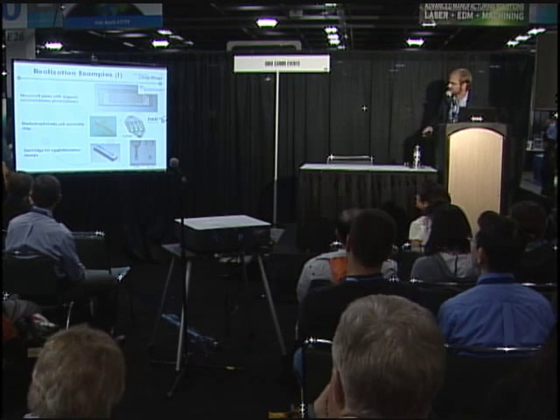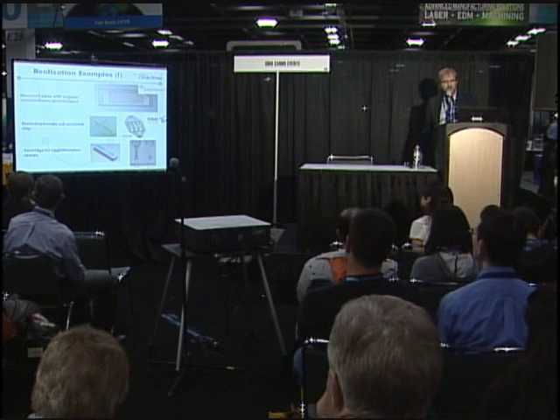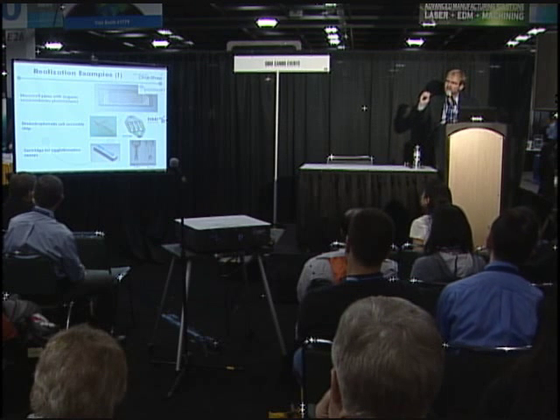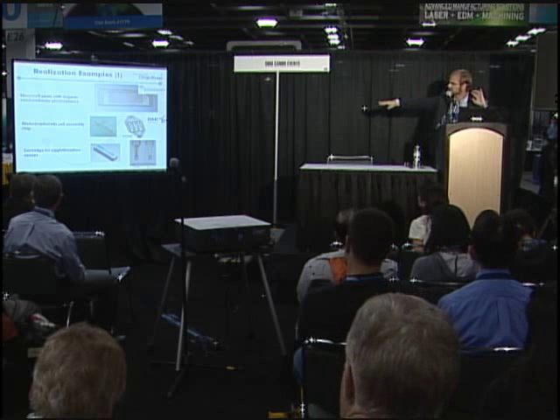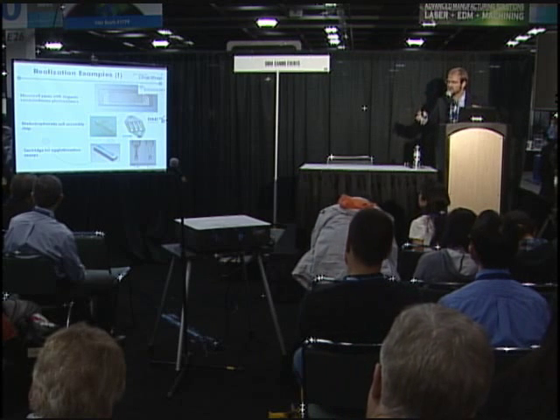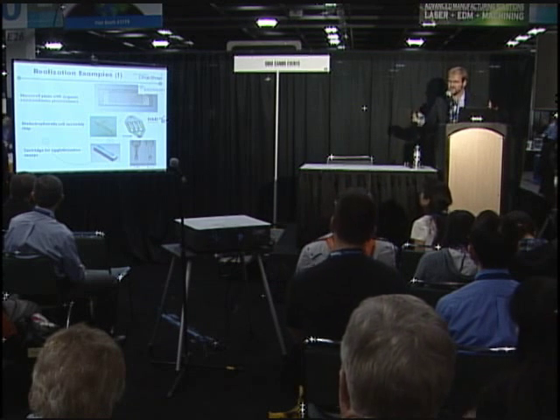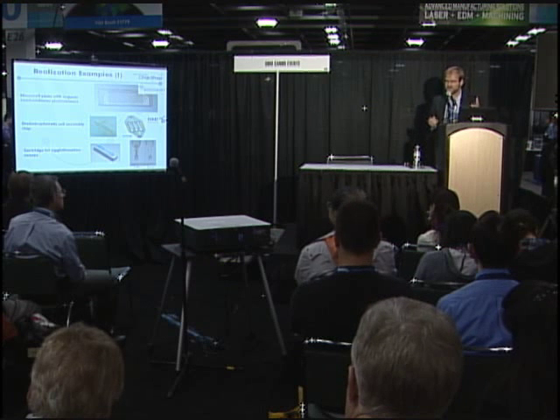And a final one, that's a diagnostic cartridge for agglutination assays. Again, a fairly nice one, because in this case, that takes advantage of the original advantages of miniaturization. In the normal cartridges, you have a gel, which is antibody coated, which you have to first fill in. It limits shelf life. It has problems in keeping everything upright, it's fairly expensive to fill in.